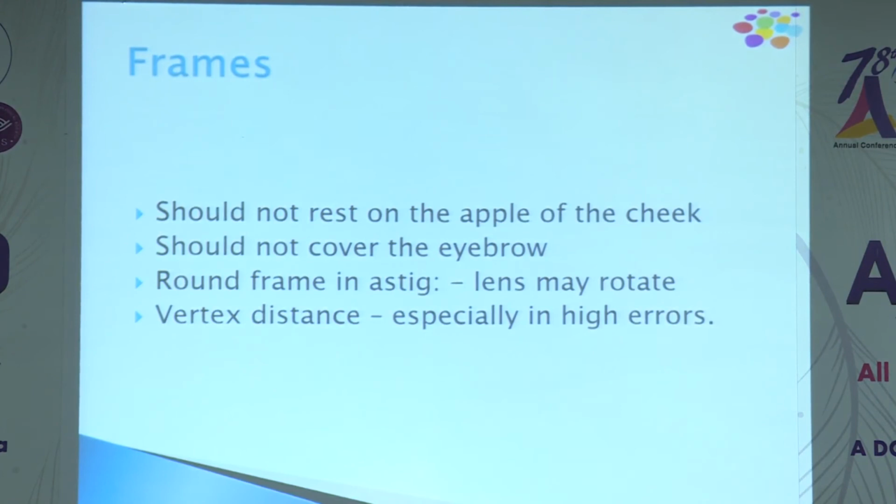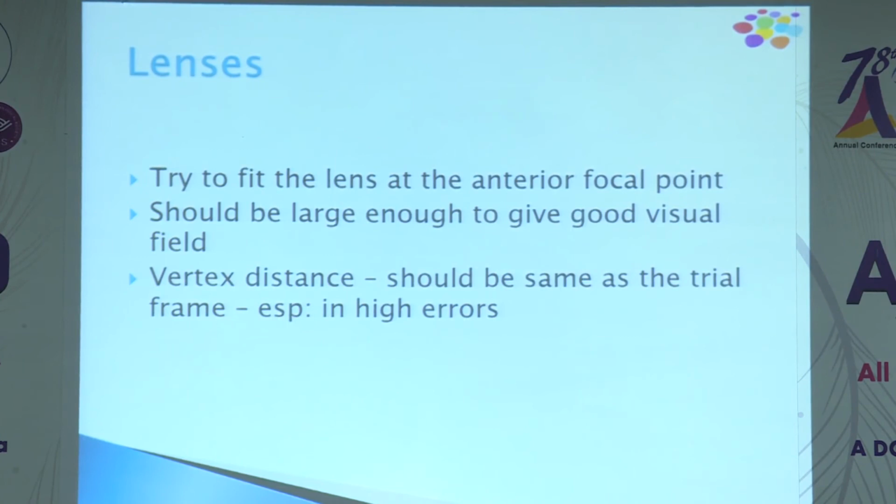Nowadays the Gandhi frame is coming back, so you have to be very careful about fitting, because the cylindrical power can rotate. Vertex distance, especially in high errors, is very important. Try to fit lenses at the anterior focal point, and they should be large enough to give a good visual field. And vertex distance is very important.